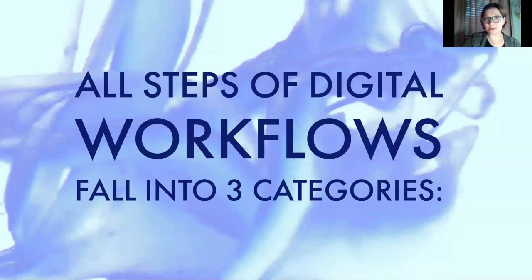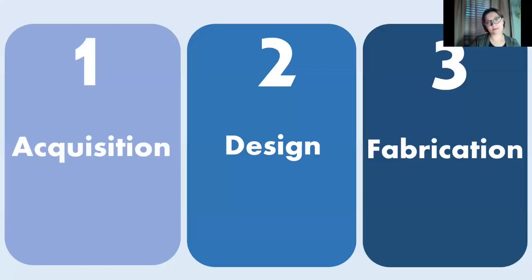Every single digital dentistry workflow, including digital dentures, has all the steps fall into one of three buckets. And those buckets are data acquisition. So bringing in data about your patient. It could be an impression, a photograph, a bite registration, a CBCT. And then you take all that data that you've acquired and put it together in your design software.